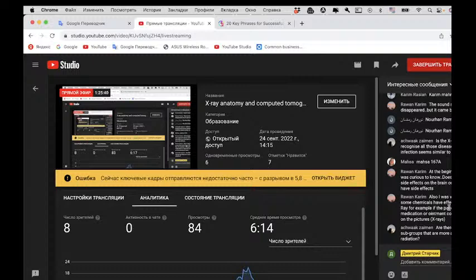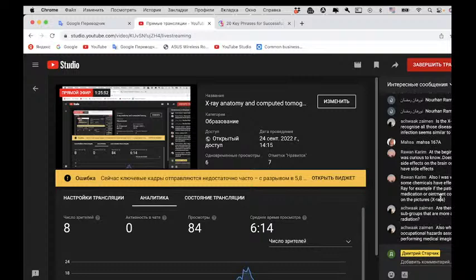Another question: do some chemicals have an effect on the picture? For example, if the patient uses a certain medication. I would say that barium sulfate has no impact on the internal organs, because it is absolutely not diluted in water and not possible to take inside blood vessels.